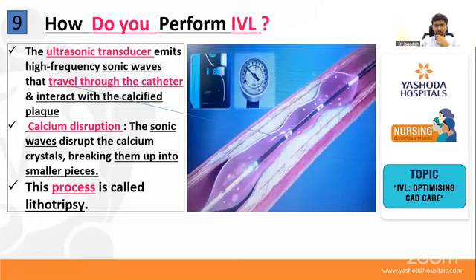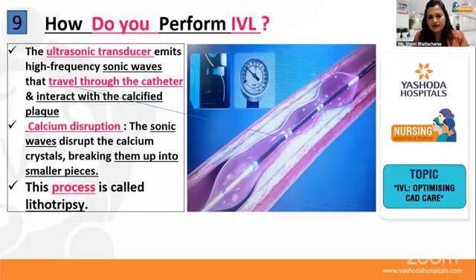So we take this balloon across the coronary artery. So this is a coronary artery, and this is a calcium chunk within the coronary artery. So I take the balloon to the calcium chunk and then inflate it to low atmospheres, like 4 atmospheres, and initiate the pulse process. Once the pulse process is initiated, we have 3 nodes here. You can see 3 nodes.